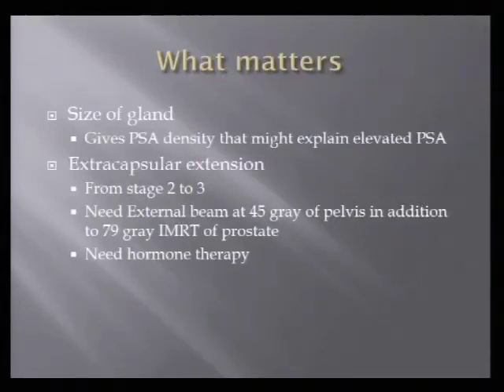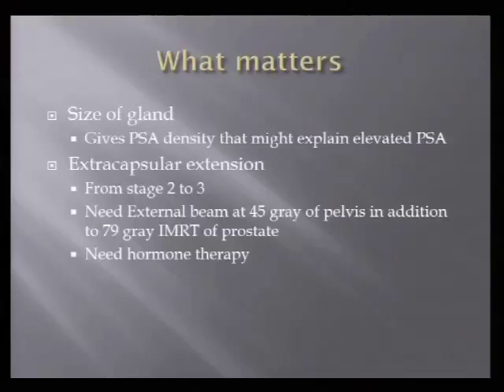So what matters with prostate MRI? I spent a month doing this, and we probably read about 4 prostate MRIs a day. And the guy I worked with, it was more than one person, but one of them was just fantastic with reading these things. He actually said one of the most important things you get out of a prostate MRI is the size. You should always put the size of the gland in your report. The reason being, a really good reason to do a prostate MRI is negative biopsies with an elevated PSA. Well, let's start with a 300 milliliter prostate explaining why the PSA might be elevated. So you don't want to go down the road of, oh, I'm not finding the cancer. You kind of lose the forest for the trees. So mentioning the size of the gland is very important.